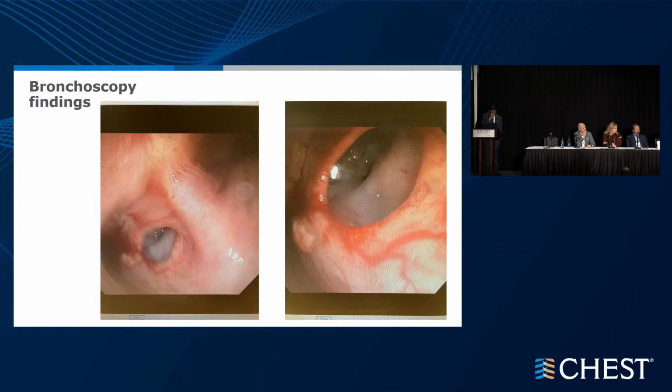And so as my GI colleague was trying, his goal was to stent and try to see if he could open anything up, just palliative reasons at this point. He put in methylene blue saline in there, and we saw it leaking through. And he tried to get the wire in there, couldn't get the wire in there for the life of him, couldn't kind of traverse the esophageal obstruction at this point.